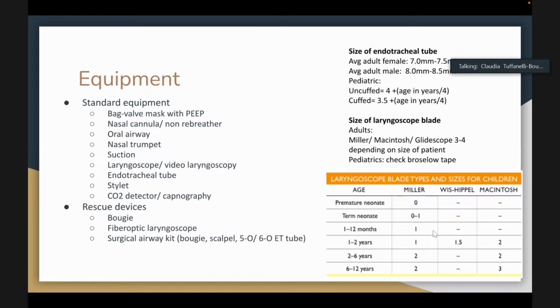These are the little things you can put in the mouth just to open up. These are valuable during bag valve mask ventilation. If the patient has a beard or they have no dentition, meaning their teeth are missing, these are valuable. Nasal trumpet, something you could stick in the nose if you need to help with ventilation.